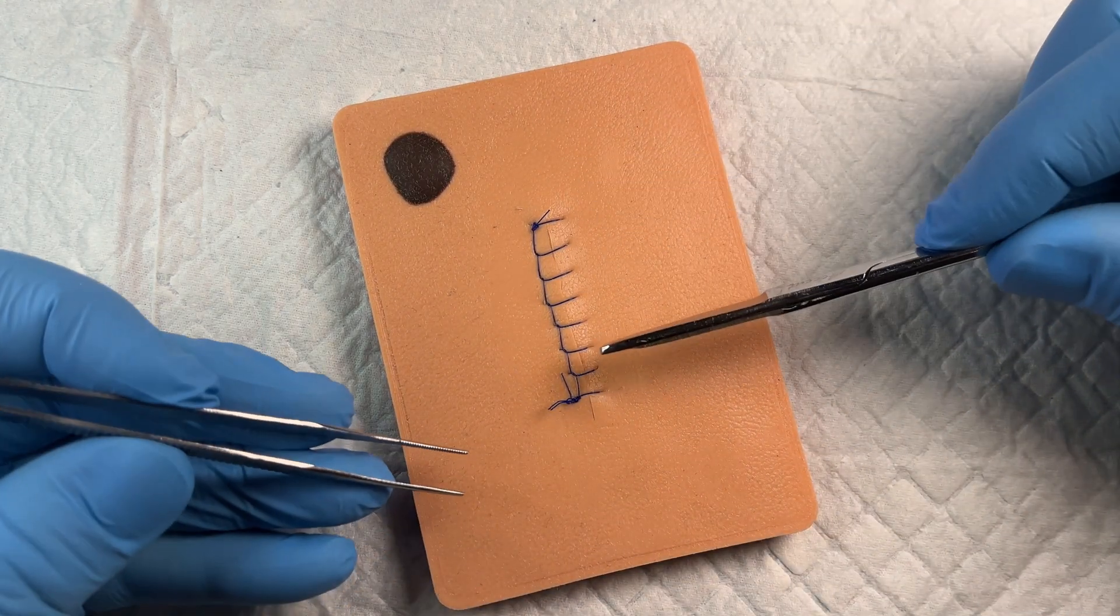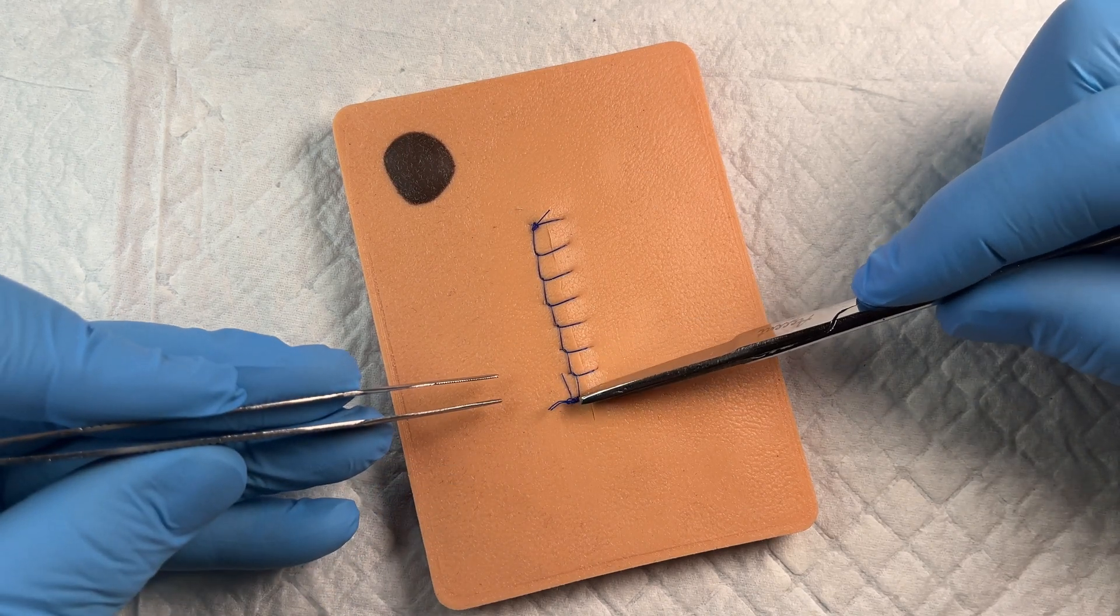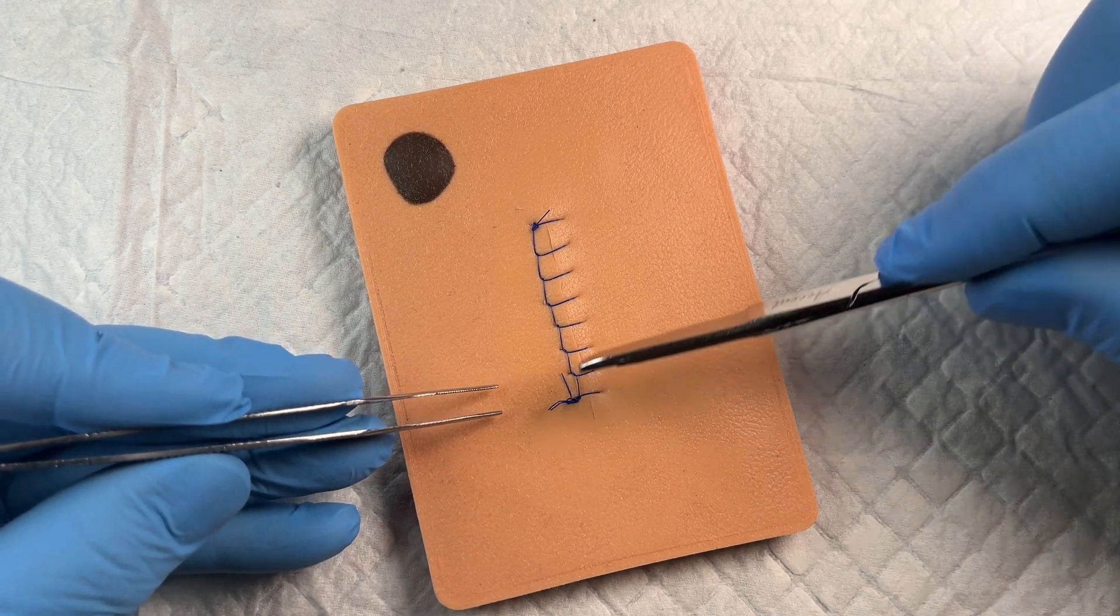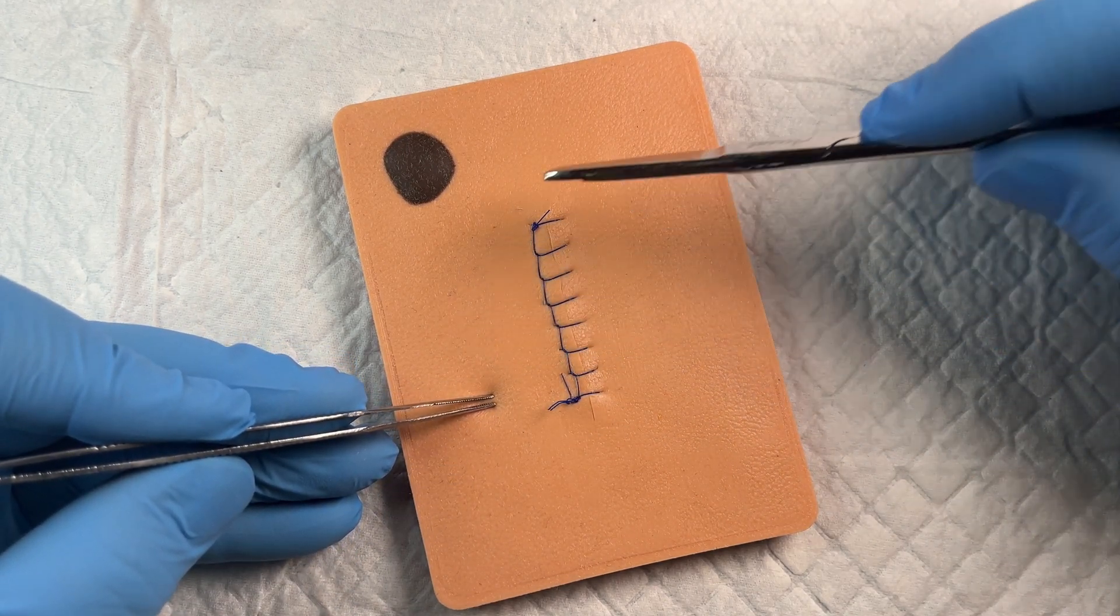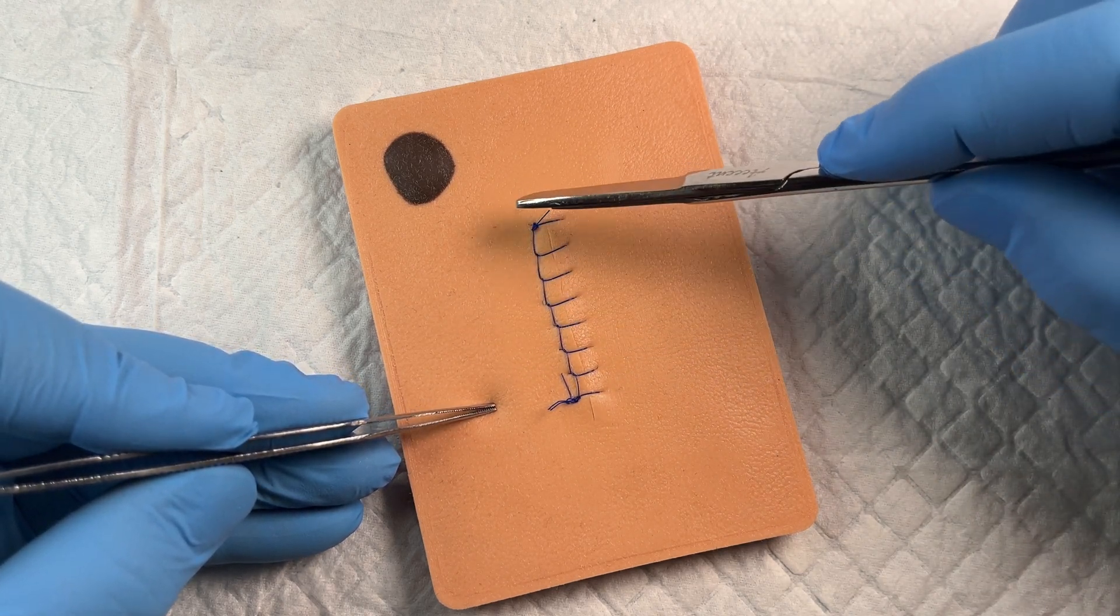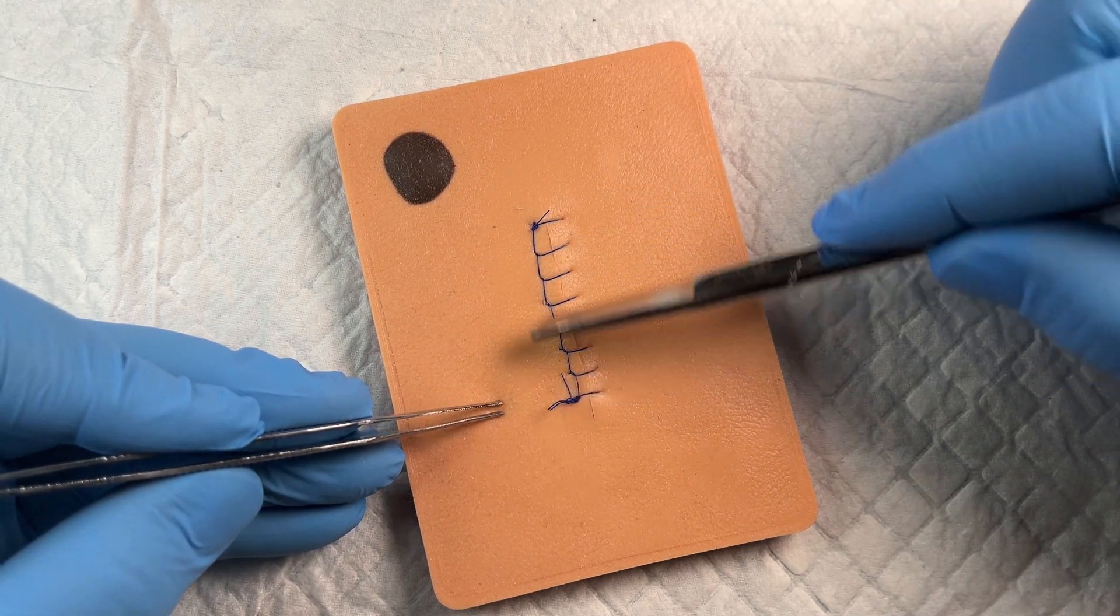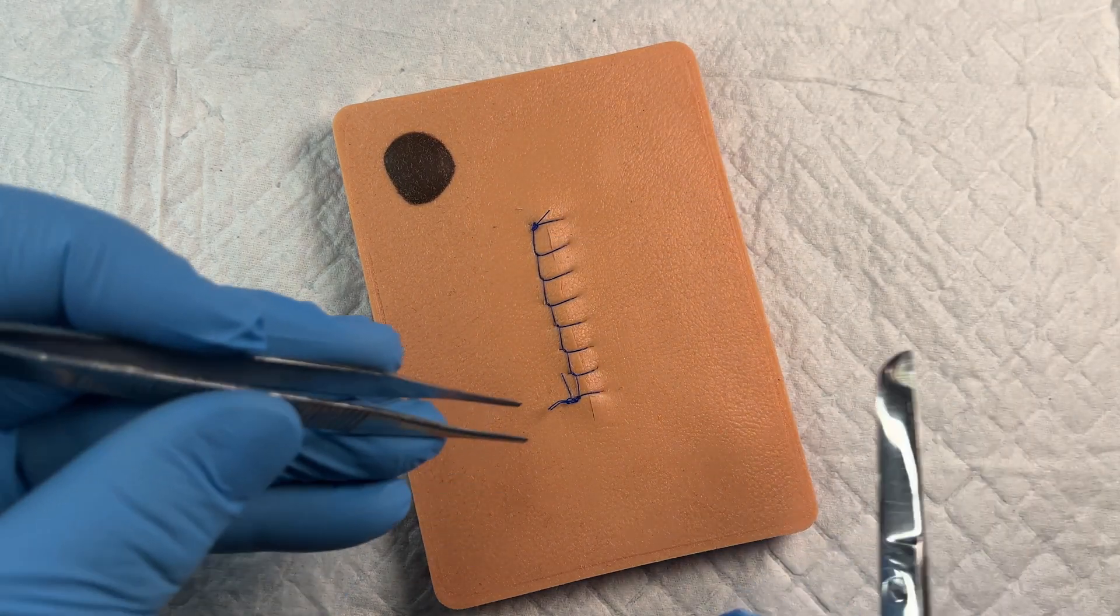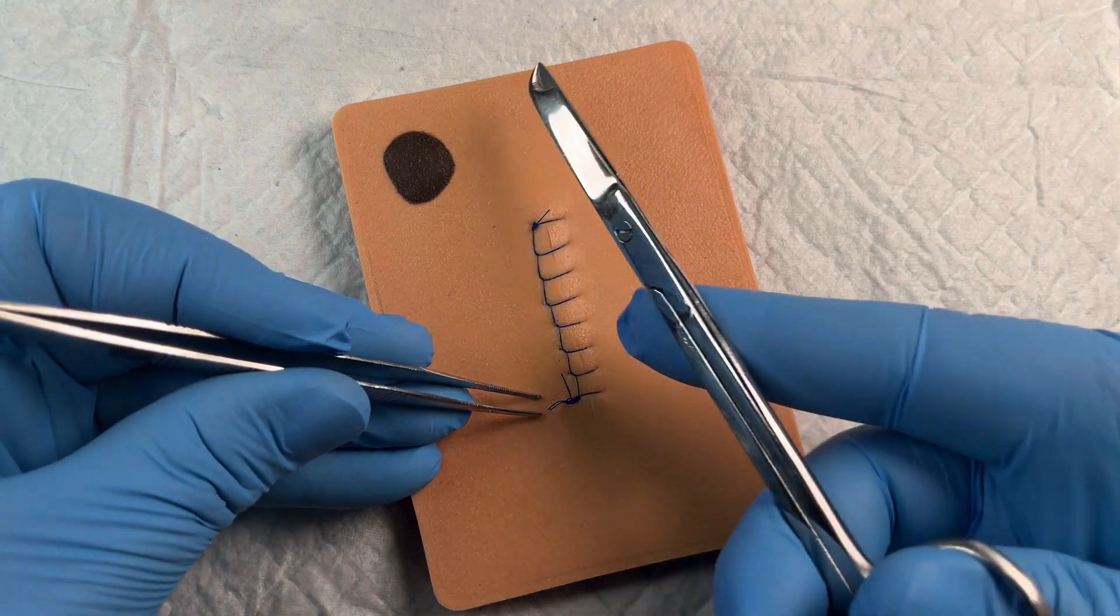So commonly what I've seen in the past with these is the suture will be cut at one end and then it's just dragged out length by length and it continually gets longer as you remove a new segment every time. But you need to remember that as you're doing that, you're just dragging the whole suture with its bacteria through the tissue.